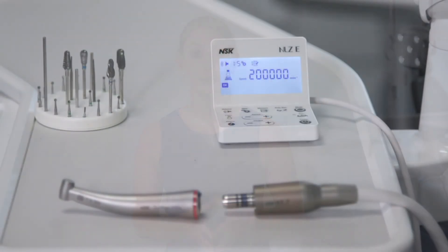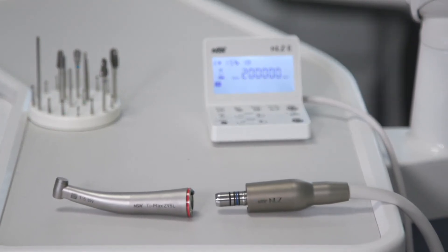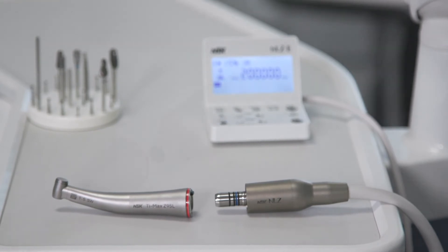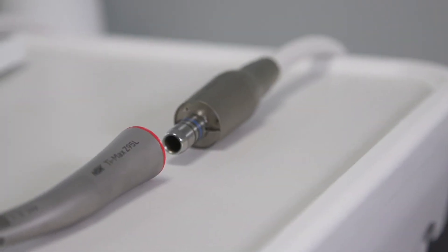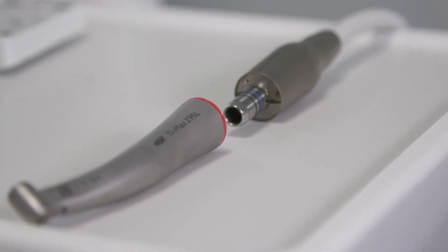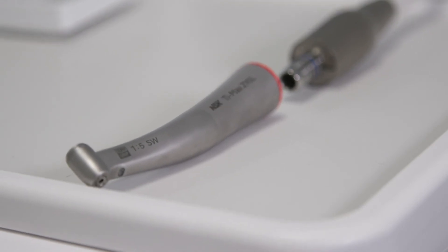When using and maintaining a red band handpiece, it's important to note the following. Never use this handpiece without water. Friction generated by cutting at high speeds creates increased heat, and using it without water can overheat the handpiece and burr, which can cause burning to the tooth, restorative material, or the patient. Although the red band handpiece has increased speed and torque, applying excessive pressure while performing procedures can cause premature damage of the handpiece.